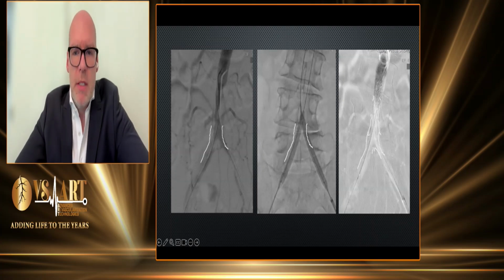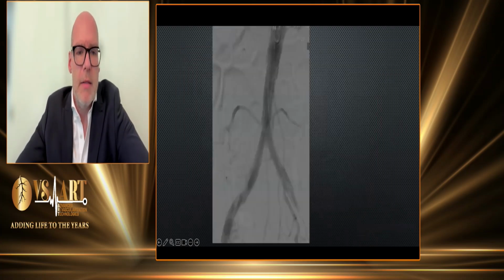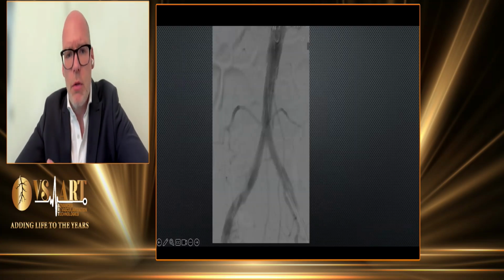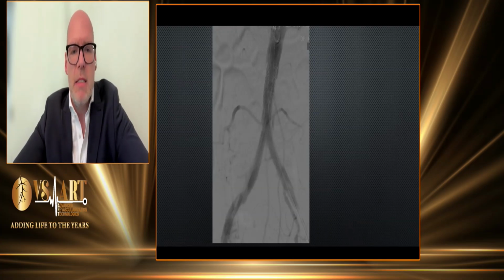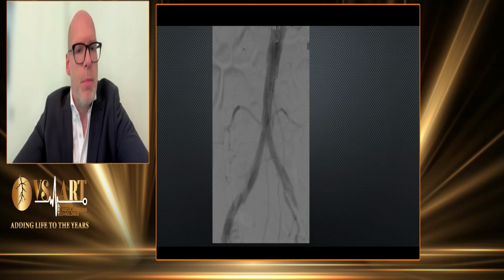So we went further with the CERAB technique, placing an aortic stent, flaring it in the proximal part, and continuing with the iliac stents. It was a good result. What we started with as a normal iliac stent on the right side ended up as the CERAB technique. So we have to be prepared to deal with such cases, in my opinion.